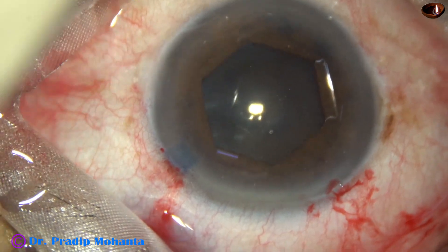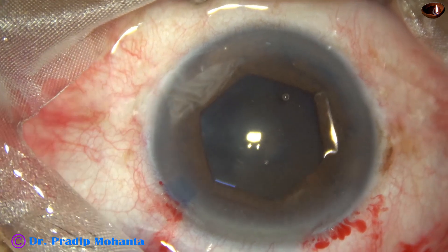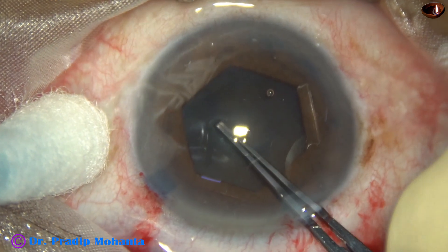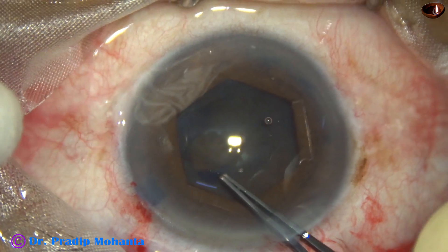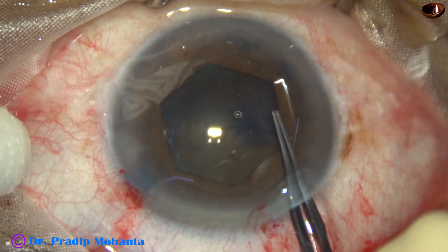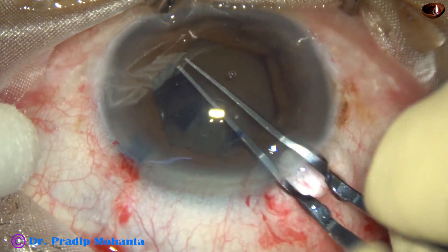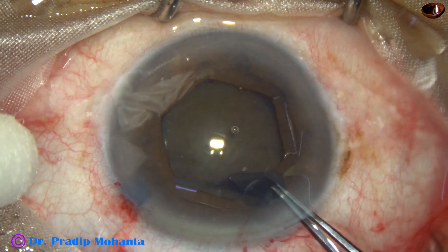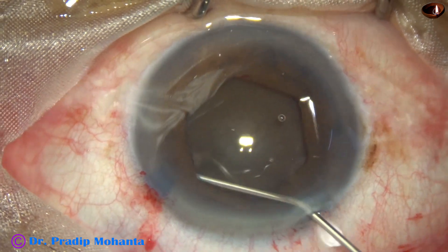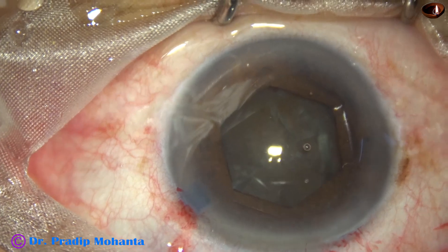I am removing some cortical fibers using the B-hex forceps itself. Now it is time for capsulorrhexis. My plan is to do a 5.5-millimeter capsulorrhexis going along the border of the hexagonal pupil. In some places it is under the iris, and at the corners it is visible. I obtain an adequate rhexis of about 5.5 millimeters to manage this hard nucleus. Unless this size of rhexis is obtained, it is difficult to manage the nucleus — there will be a lot of zonular stress and other complications can occur.